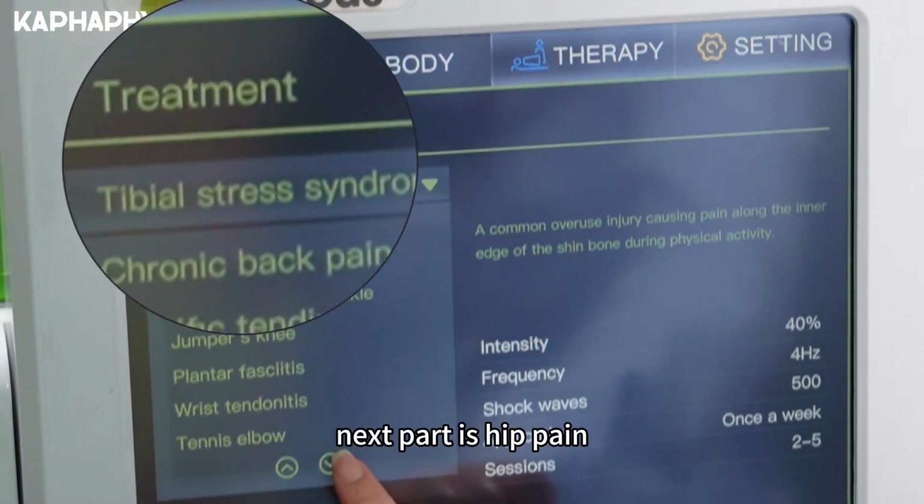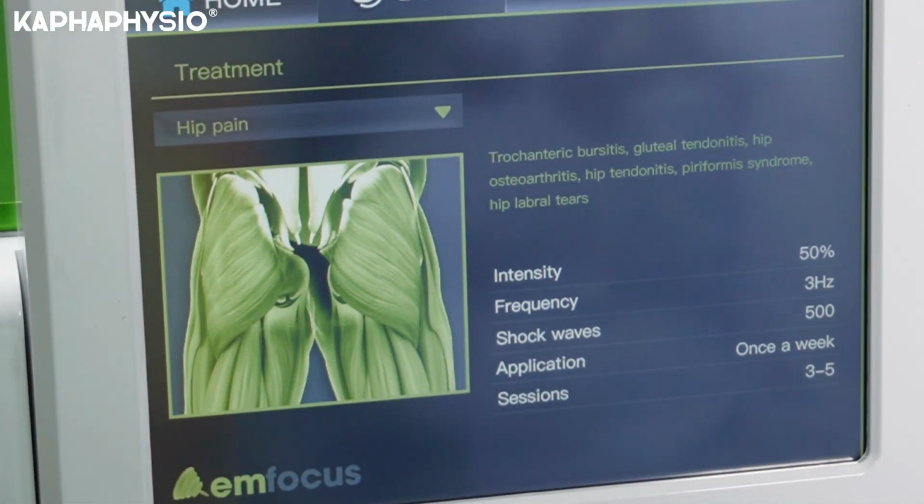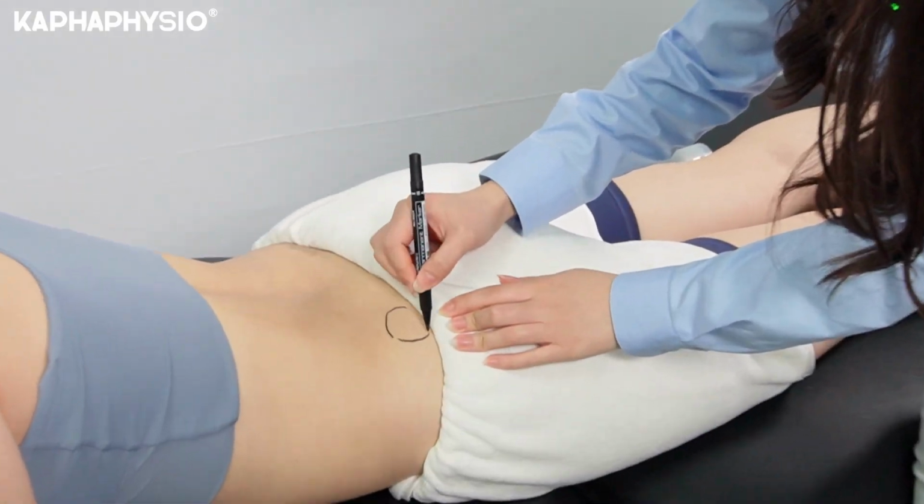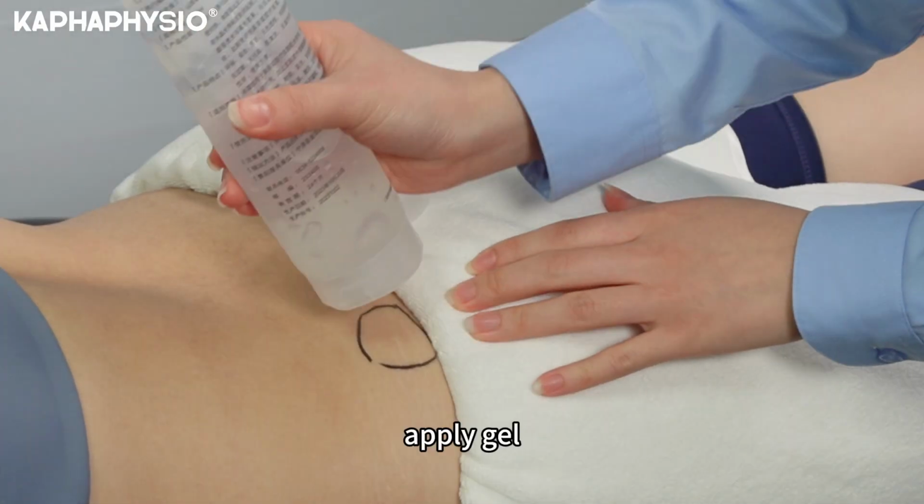The next part is hip pain. Find the trigger point. Apply gel.